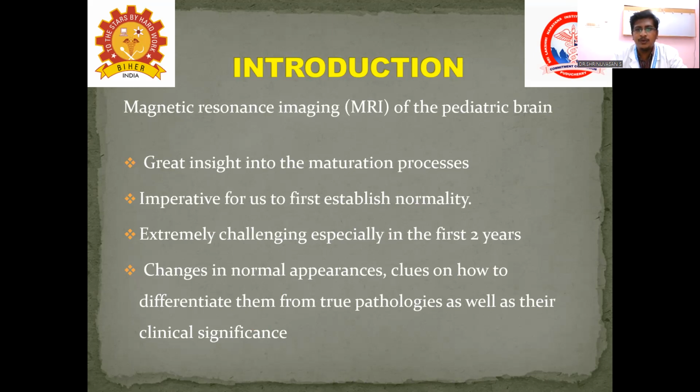and our human body, which is composed of 70% water and 30% other tissues and bony materials, will give you the signal. The 70% water means the hydrogen atoms in our body act like tiny magnets, and these tiny magnets resonate at different frequencies. When we keep the human body in the wide bore of the high Tesla MRI, these hydrogen atoms, which act like tiny magnets, resonate at a particular frequency and produce images.